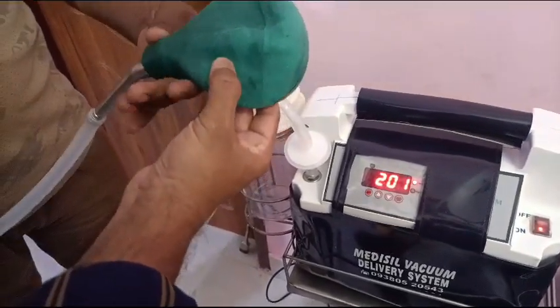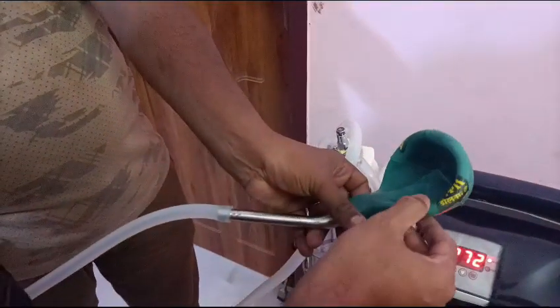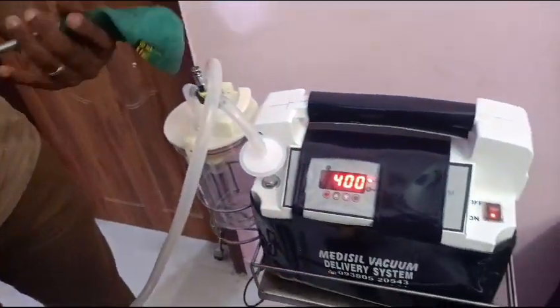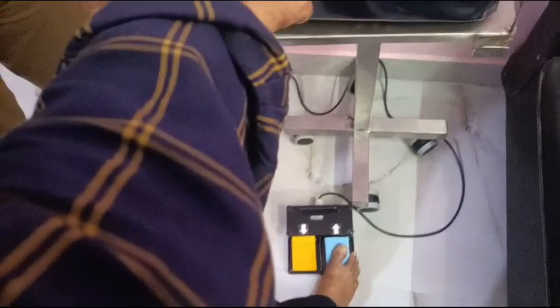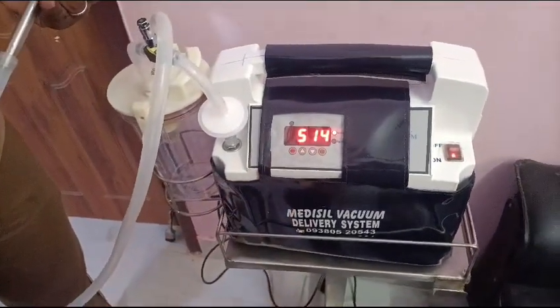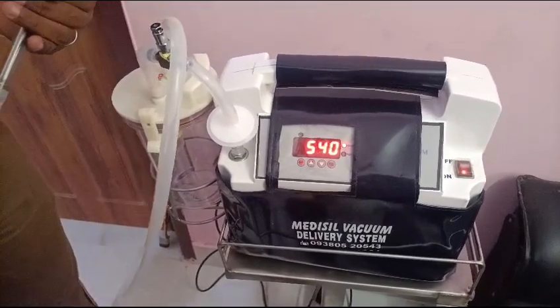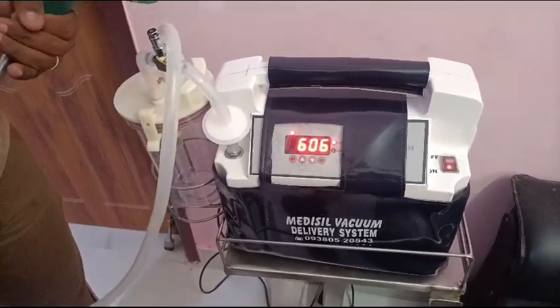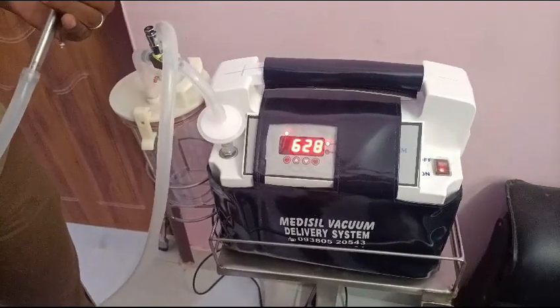So the uterine cavity shrinks. This is a small rubber, so it shrinks very fast, but in our case it goes slowly. With the foot switch you are increasing the vacuum. You go up to 600, and then 650 to 700.